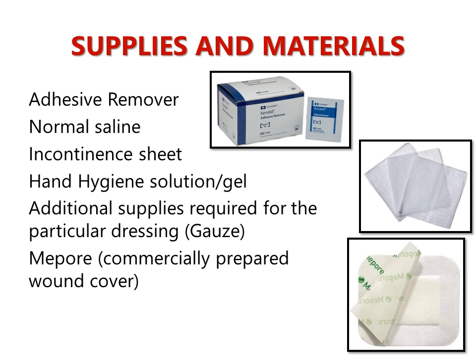Next is normal saline solution. This saline solution will be used as a cleaning agent. Again, it depends on the hospital. Some hospitals use normal saline solution. Some other hospitals have their own cleaning agent, and you need to ask that in your workplace. Incontinence sheet or inco pad. What else? Hand hygiene solution or gel for hand hygiene.